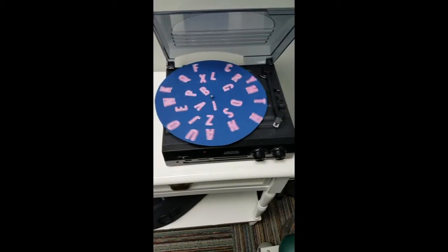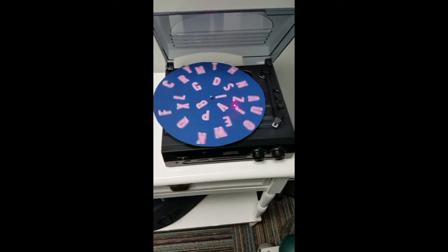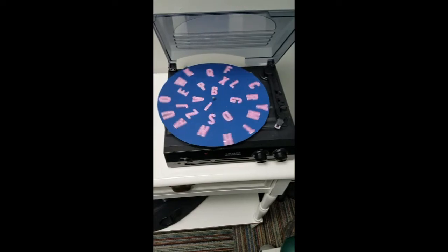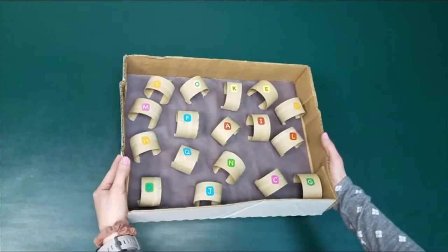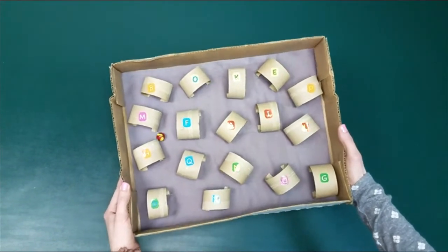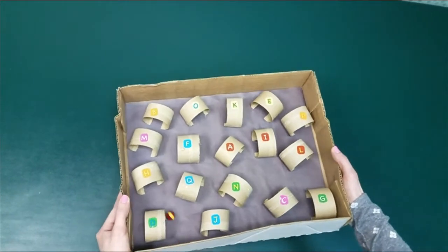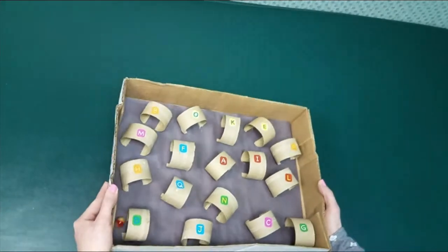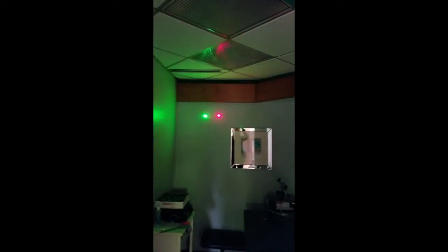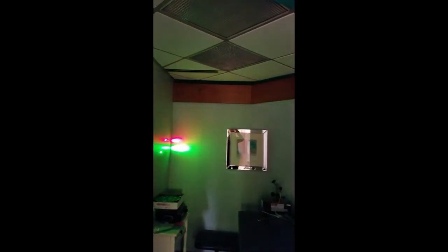You can easily do this with a record player, and you can scan for sequencing of your letters as the record player turns. You can also make a marble tunnel, again sequencing letters, following the marble through the tunnels, working on eye-hand coordination in order to make the marble go where you want it to. A definite necessity to have within an OT vision clinic is laser pointers. If you have two different colors, you can play fun games like flashlight tag and follow the leader.